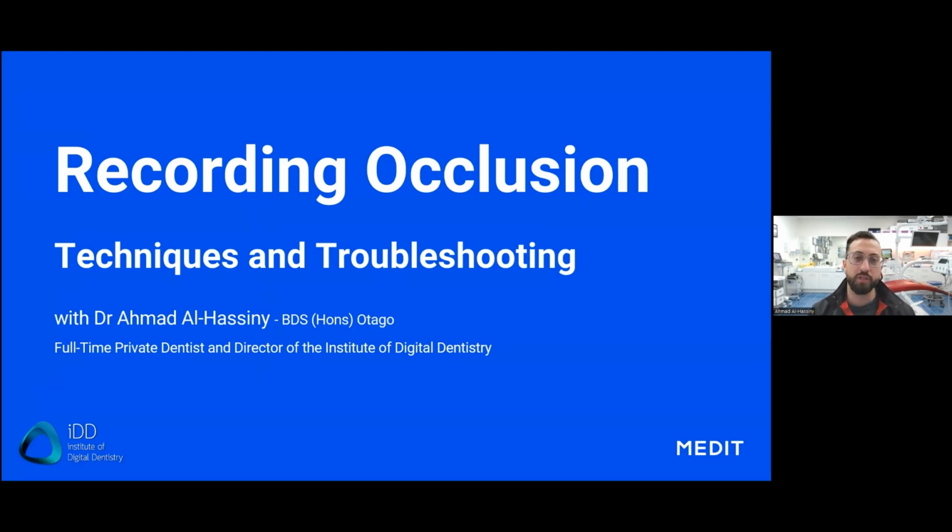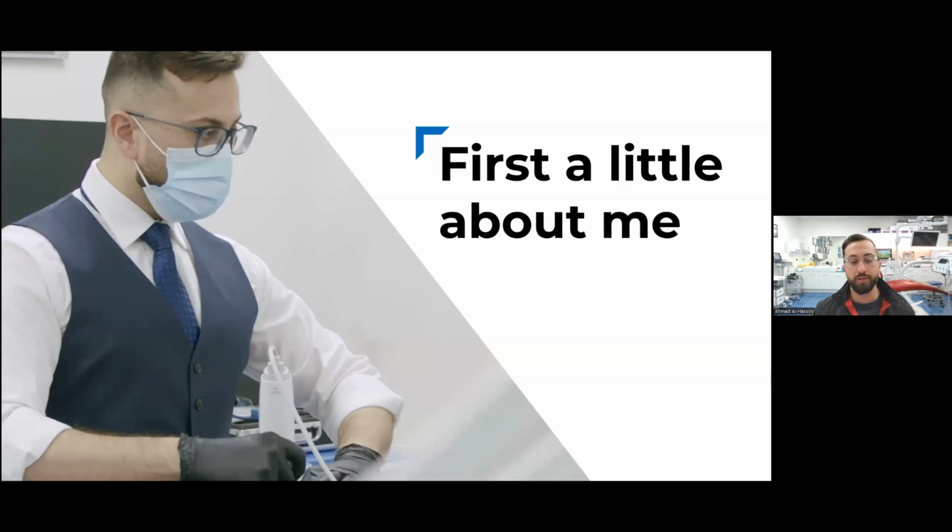What I wanted to do is share a couple of tips and tricks and go over how you correctly record occlusion, and all the little troubleshooting issues that can happen and how to solve and fix them.